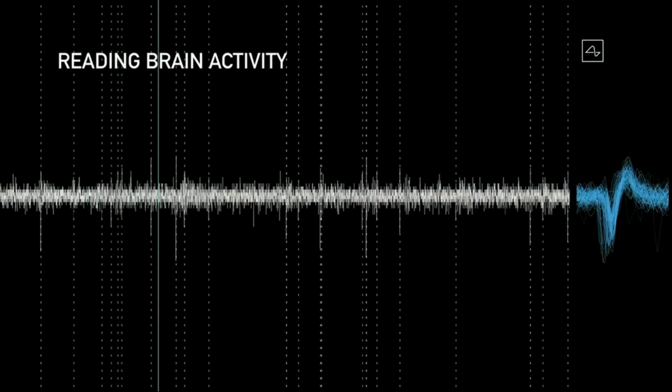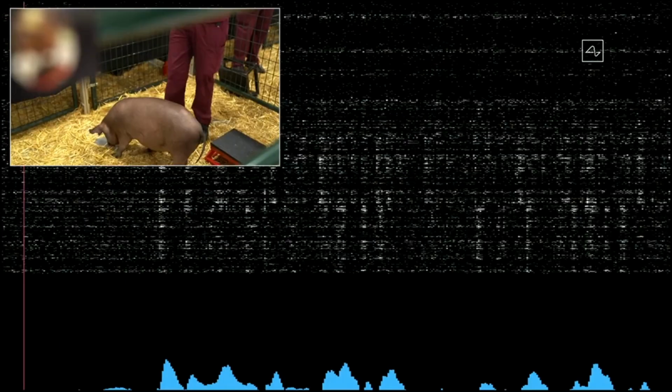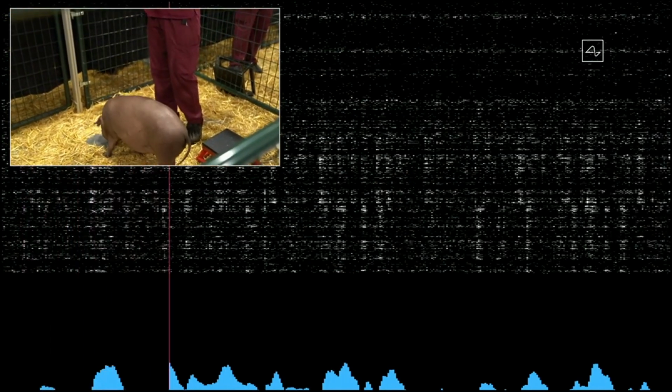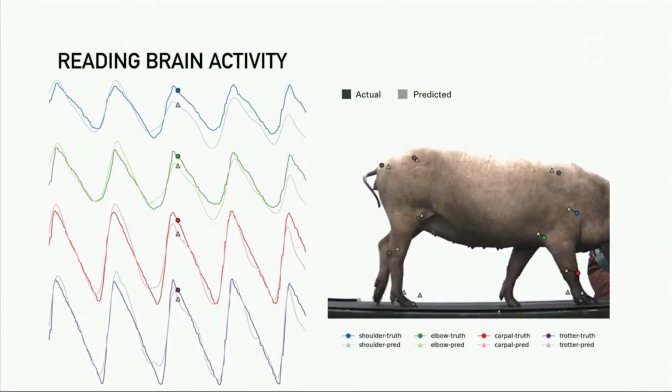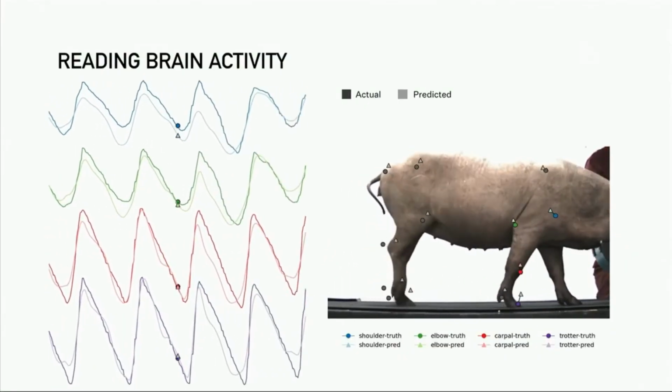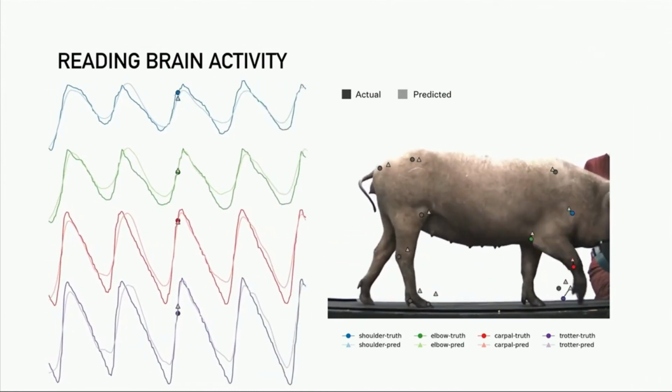During the demonstration, they showed us how the implant could send data from the brain of a pig test subject to a computer. The receptors were connected in such a way as to measure the contact with the snout and also movements of the limbs, allowing the computer to track each movement in real time. There was also a demonstration of data being written directly to the brain, where you could see a single electrode stimulate up to 1,000 neurons.